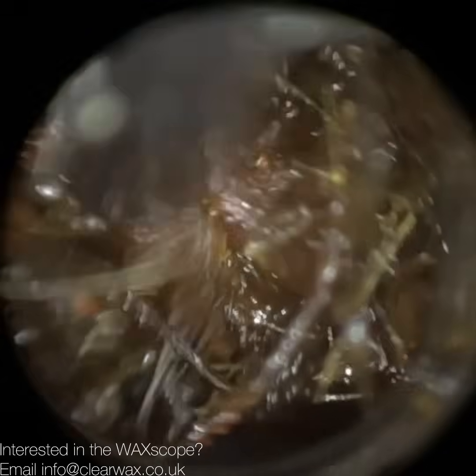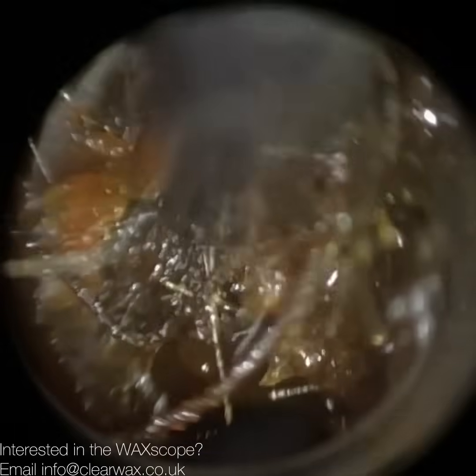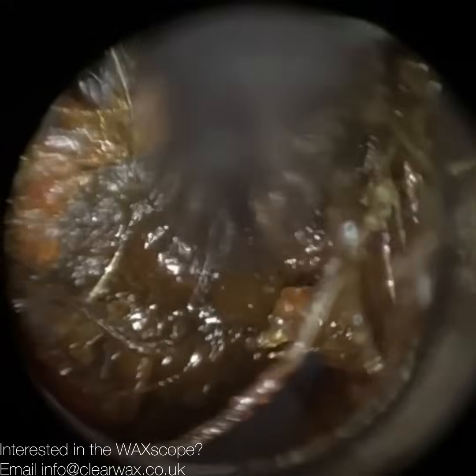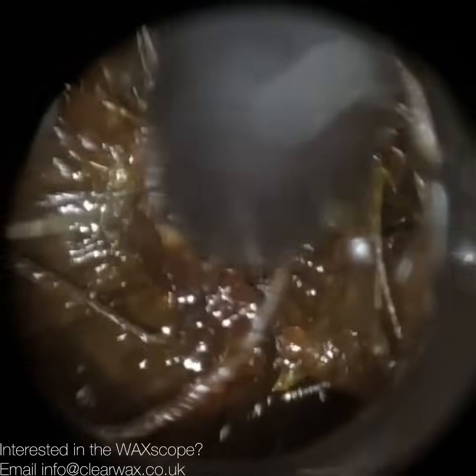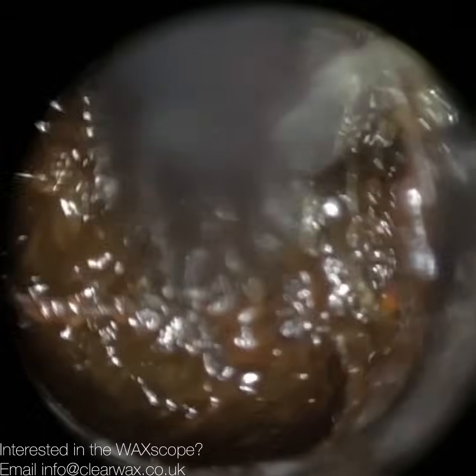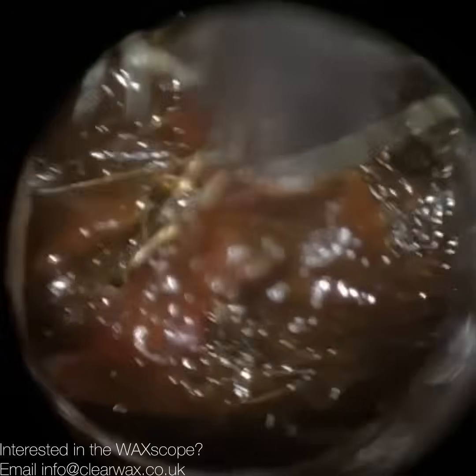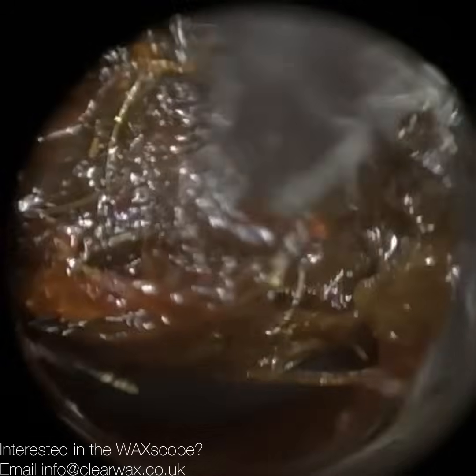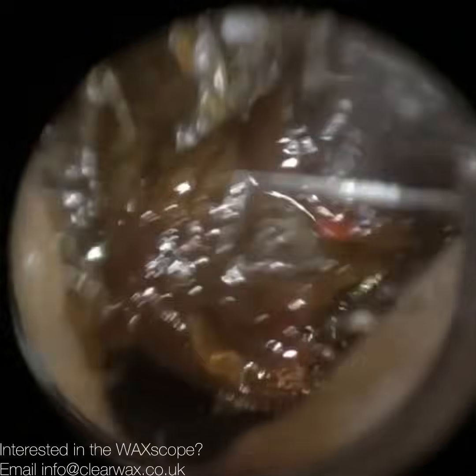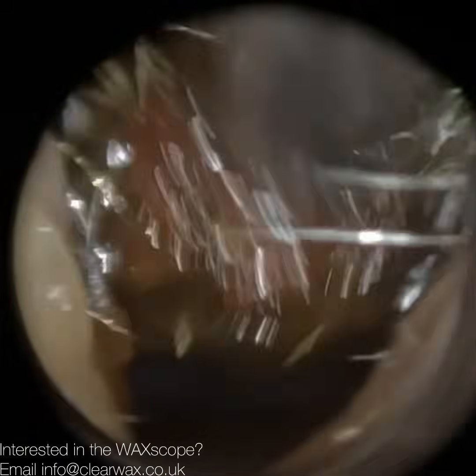With an endoscope, you're continuously having to hold the endoscope, and that's normally held in your non-dominant hand as well, and quite often it's not supported when you're holding it, so you're holding it in mid-air, suspended in the ear canal. Sometimes you can rest it against the ear canal wall. It depends on the type of procedure and whereabouts the wax is in the ear canal. But when you've got the speculum, it really does stabilize things. So for that reason, they've both got their pros and cons. I think ultimately, the endoscope is unrivaled, but the WAXscope, for me, and it's very biased because obviously I've developed it, is the next best alternative in terms of optics.